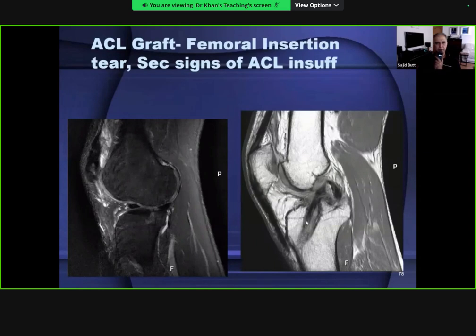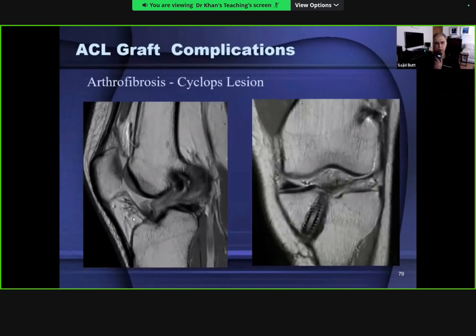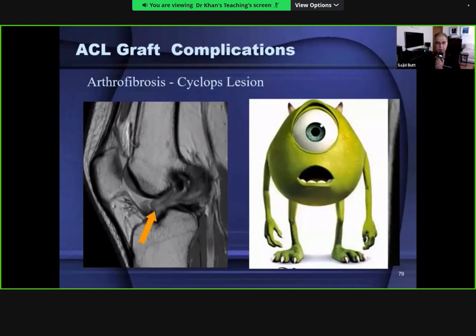Secondary signs of ACL incompetence reappear: anterior tibial draw and hook-shaped PCL. There is disruption of ligament fibers with lack of visibility of the reconstructed ligament in the intercondylar notch on sagittal and coronal imaging, and fibrosis in the anterior intercondylar notch - the cyclops lesion. Some fibrosis anterior to the ligament fibers is common, but once hypertrophied it becomes symptomatic with pain in the front of the knee joint.